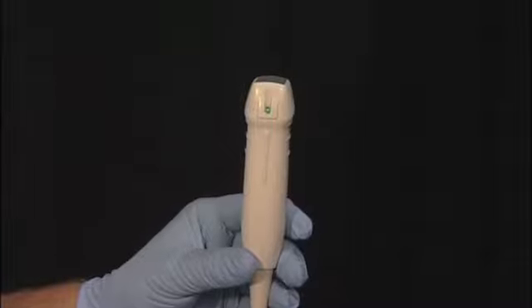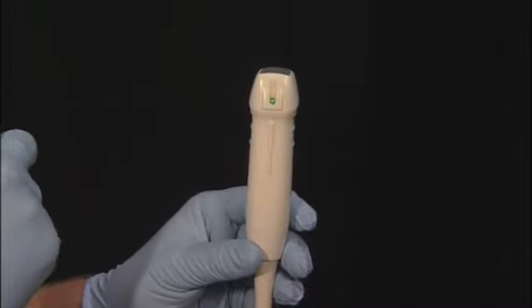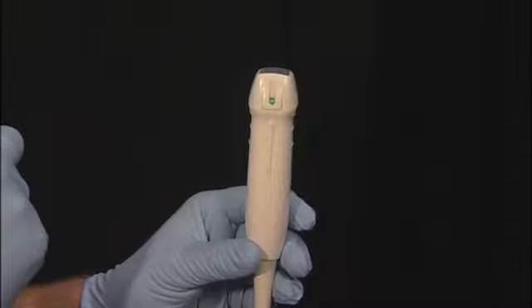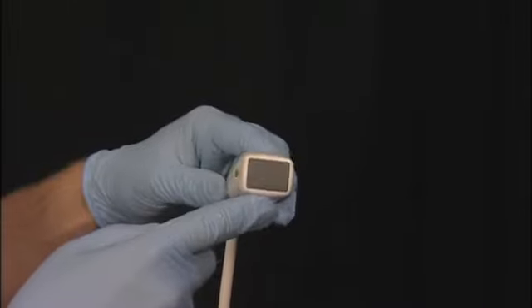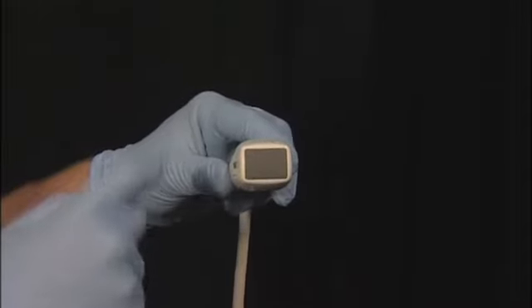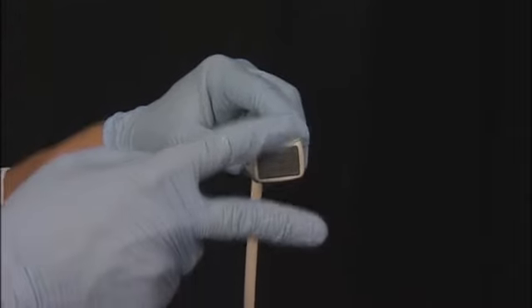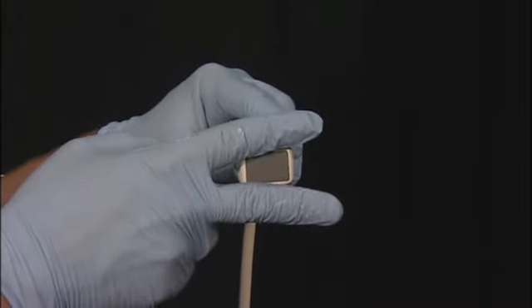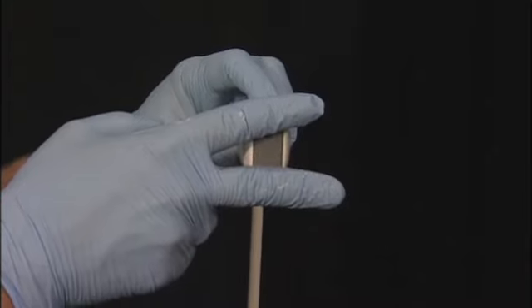A few things are important to know about the transducer. The first thing is that there's a marker which shows you where the orientation on the screen is. You can also feel the marker here. The second thing is that the crystals and the ultrasound beam is emitted from a rectangular area. So it is not the same if the transducer is oriented in this direction with respect to the intercostal space or this direction, because here you will obscure your view.